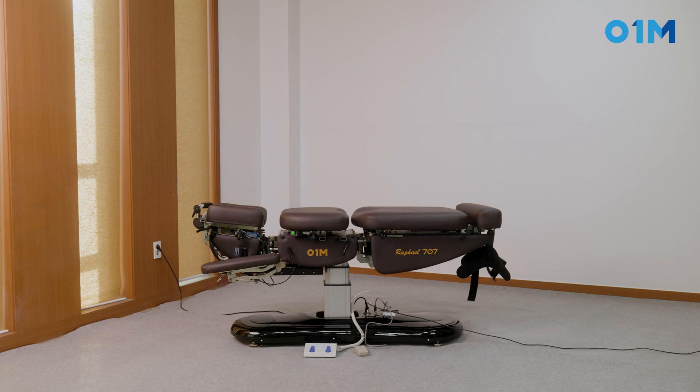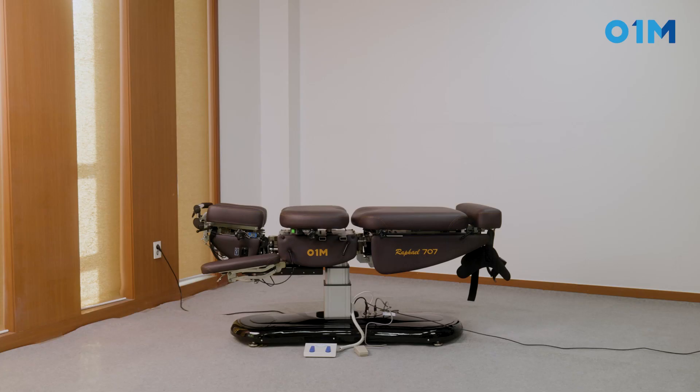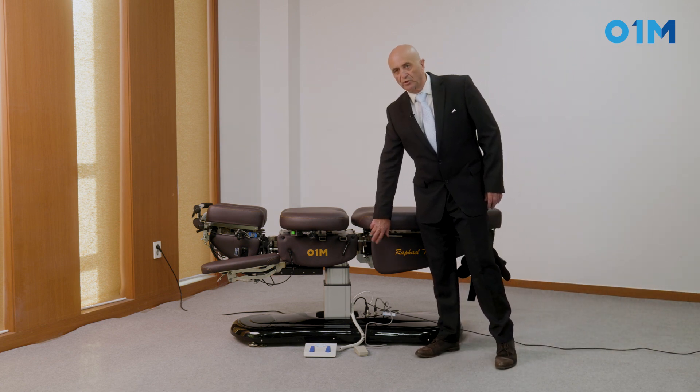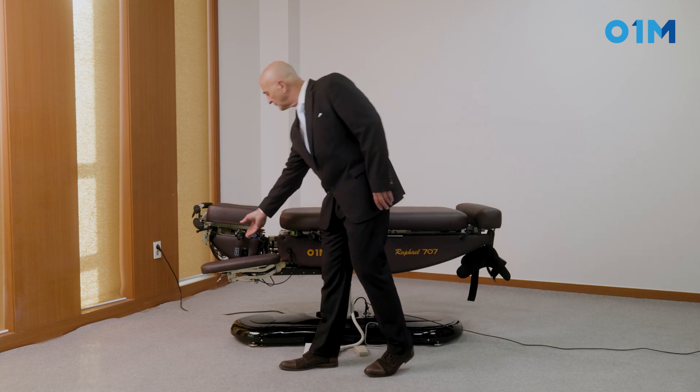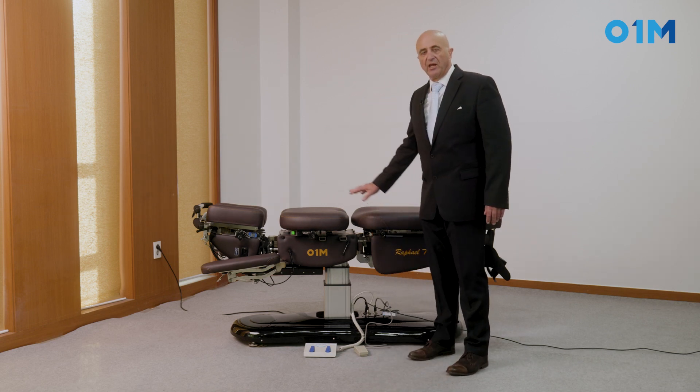To turn it off, that's it. If I select the thoracic it will do the same thing, and if I select the cervical it will do the same thing. Now, if I put tension on the drop — to add tension I'm going to turn the button clockwise — then the drop responds accordingly.